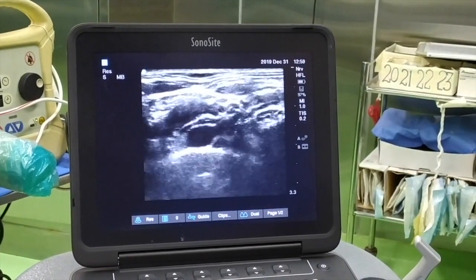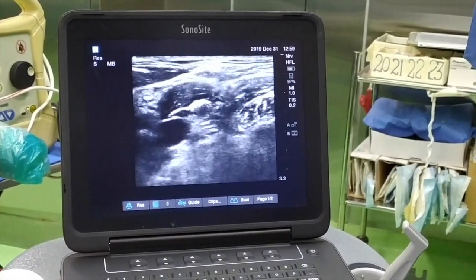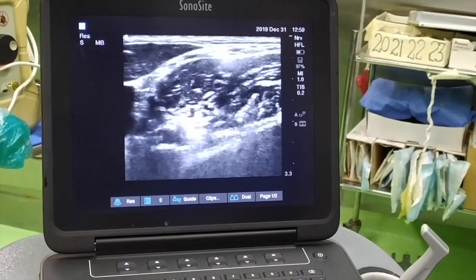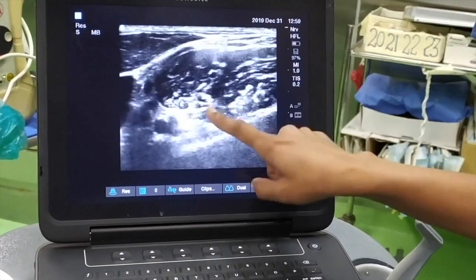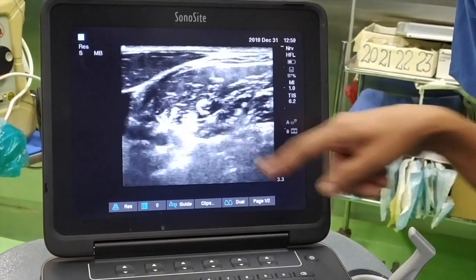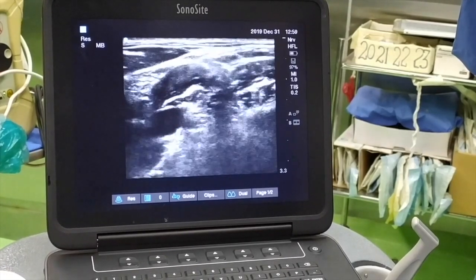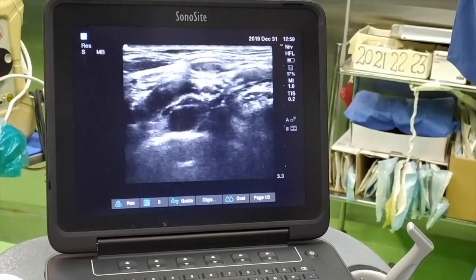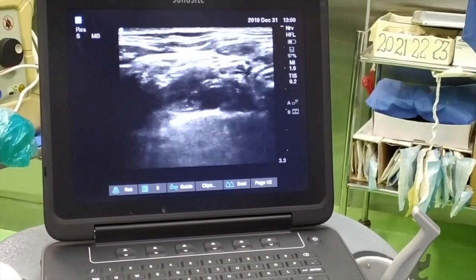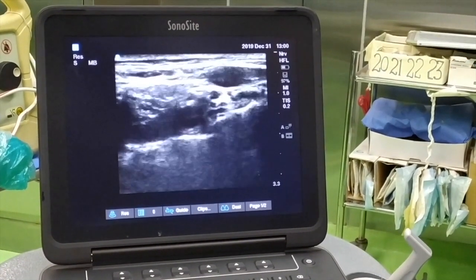Those trunks are forming the brachial plexus — a compact brachial plexus in the supraclavicular fossa. Pre-block scanning is essential to look for any deviation from normal anatomy. I am scanning upward again to look at the proper anatomy in the interscalene groove where the roots are visible, then scanning down to the brachial plexus in the supraclavicular fossa. Here are the trunks, posterior and lateral to the subclavian artery.